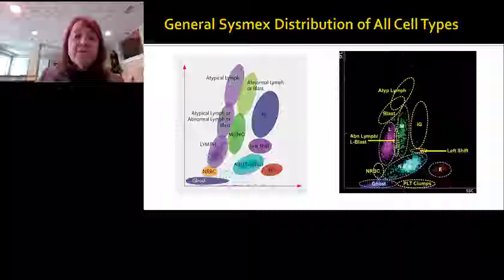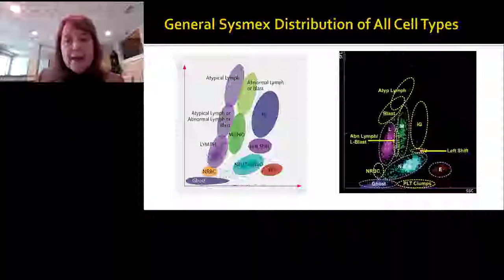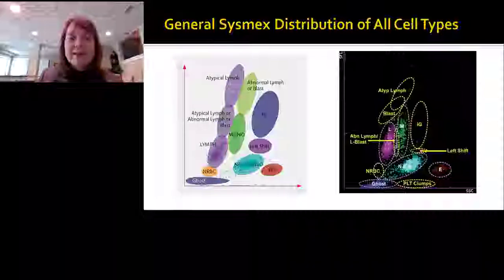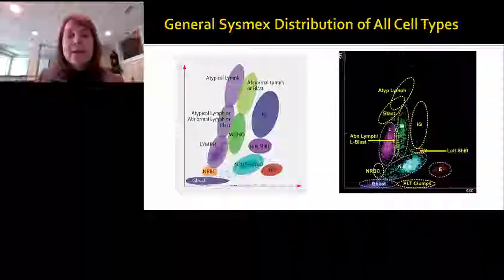All right, so we've talked of four populations. Here's our neutrophils and basos in our aquamarine on this right-hand diagram. Here's our lymphocytes in pink, our monocytes in green, and our eosinophils to the right and in red. That's typical. As I said, some may be slightly different.